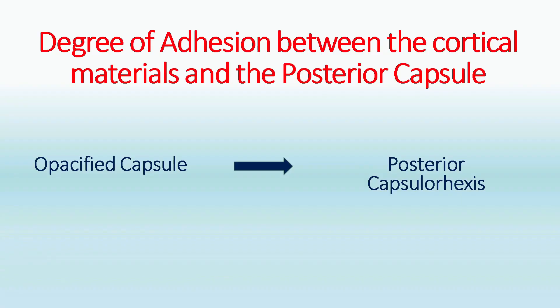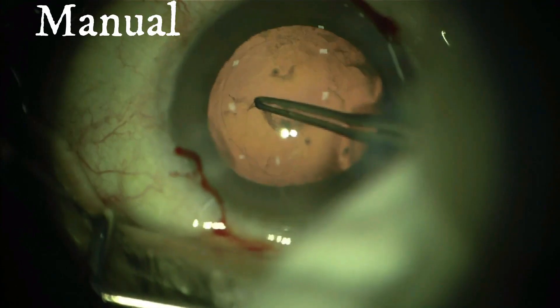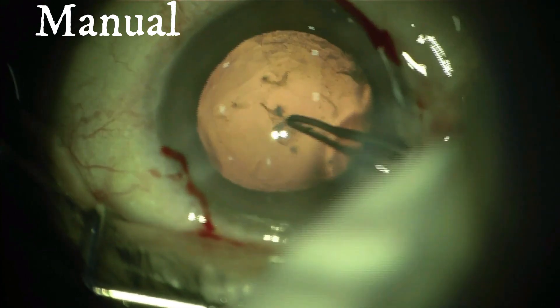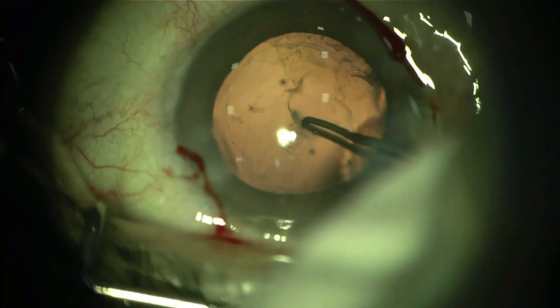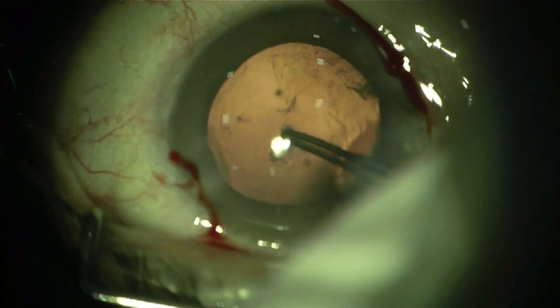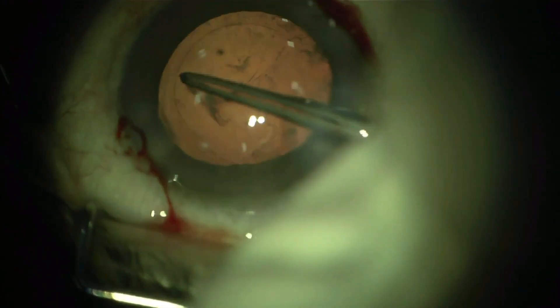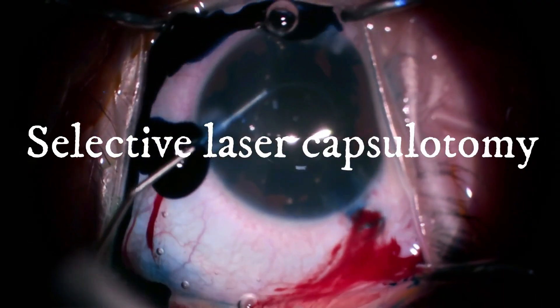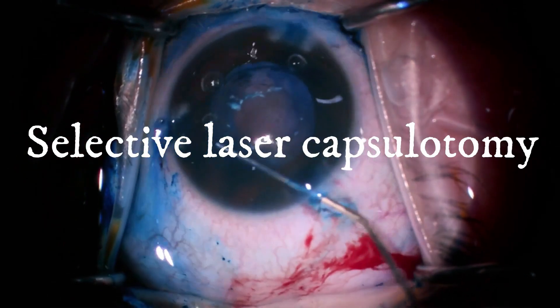When residual opacities are dense, or the capsule itself is fibrotic and opaque, a posterior capsulorexis becomes essential. This can be performed either manually using forceps or with advanced selective laser capsulotomy for greater precision and control.